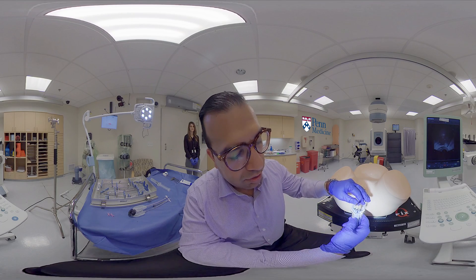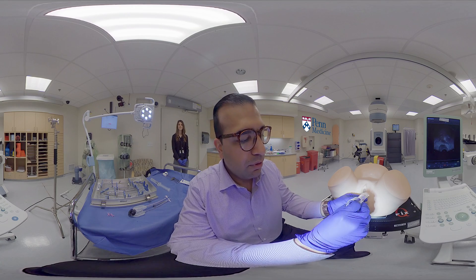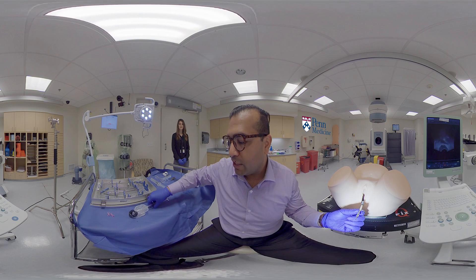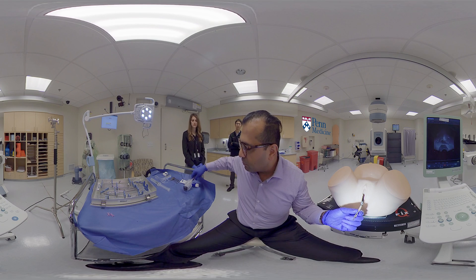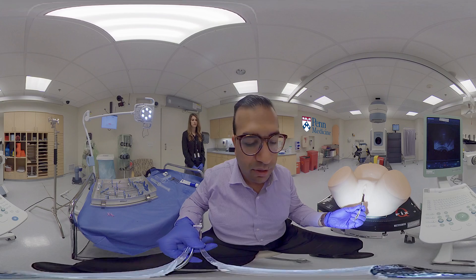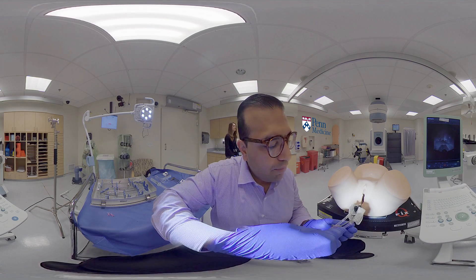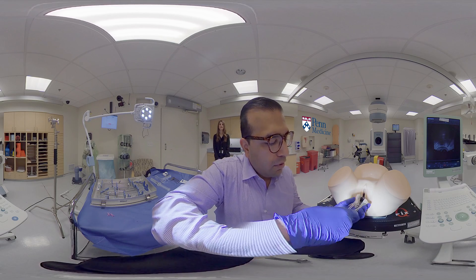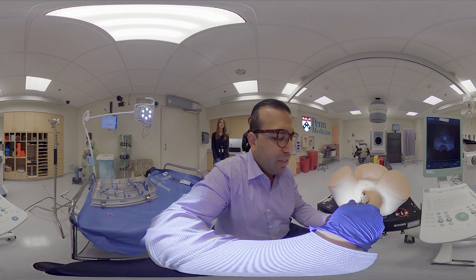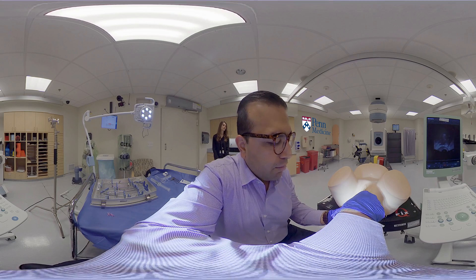You can either remove the speculum over the intrauterine tandem or you can break the speculum apart — whichever you prefer. In this method we'll just remove it over. Now the intrauterine tandem is in place. Make sure to keep forward pressure on the tandem so it doesn't come out. Taking the ring, we place a little bit of surgical jelly onto the ring and then insert the ring over the intrauterine tandem, ensuring that the intrauterine tandem is still straight and pointing upright and in the correct position. We start by inserting the ring at an angle over the intrauterine tandem, then advance the ring in place with the balloons. Separate the labia gently to allow passage of the ring, then rotate the ring applicator into place and slide it forward.